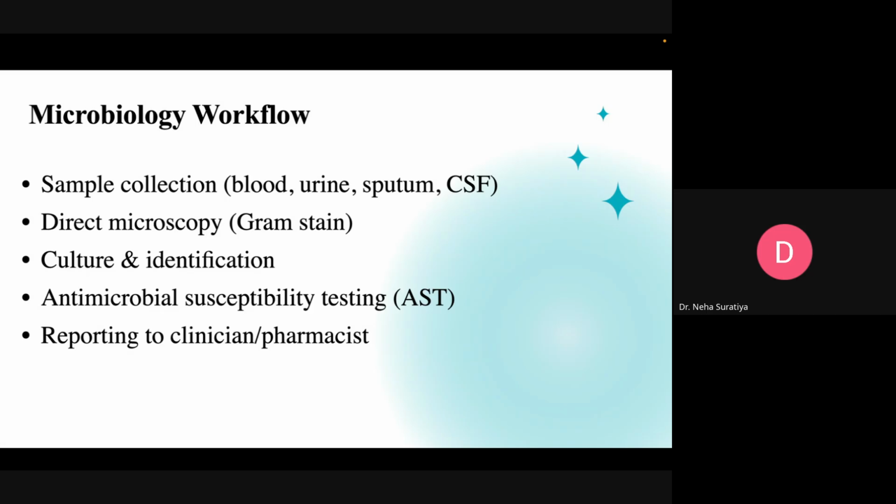Okay, final report is released to the clinician and the pharmacist. And as a pharmacist, we mainly act at step 5, guys.